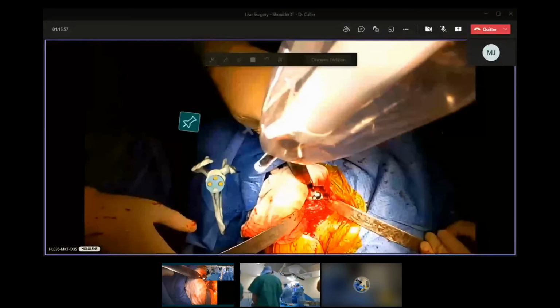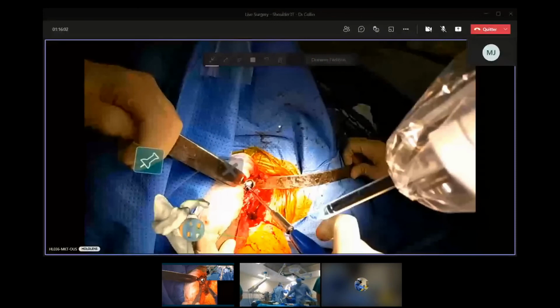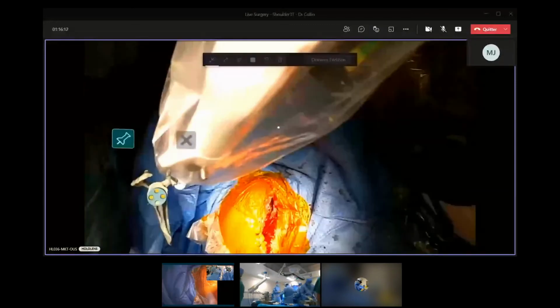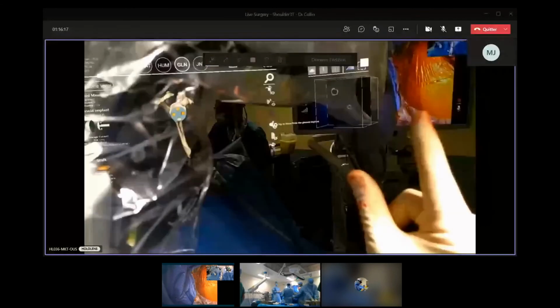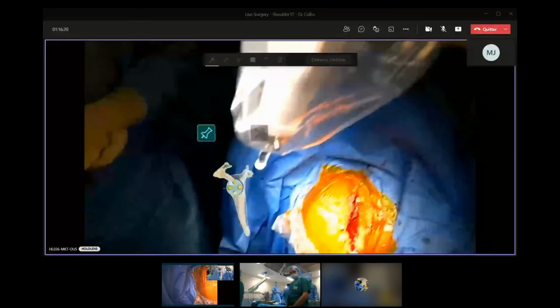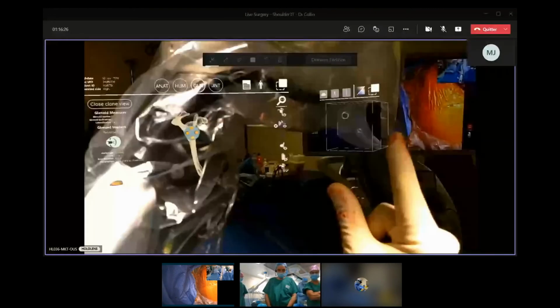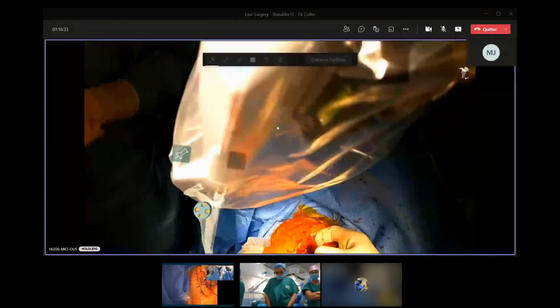So this, with this device, you need to check that you hear something. You can see, up, that's good. So normally it's finished. What you can do is to look with your sphere now. Okay. So now what you do, you are going to make some trials here, like this.